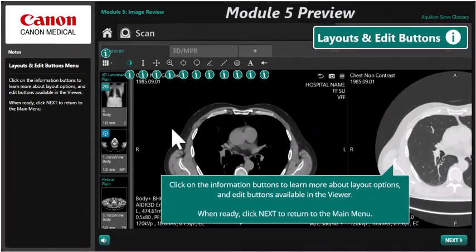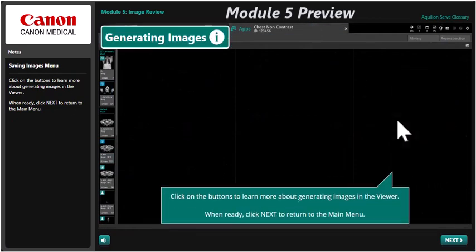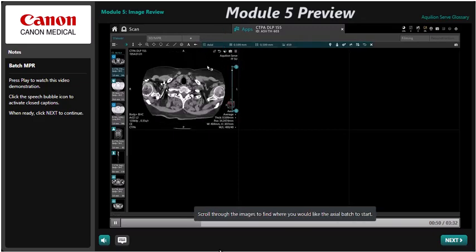Module 5 covers image review in the viewer interface. Basic post-processing and image generation are reviewed, along with a detailed explanation of all editing tools.